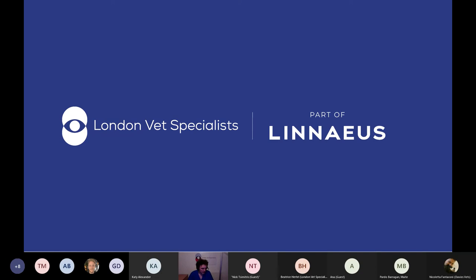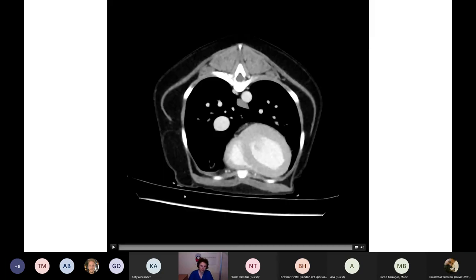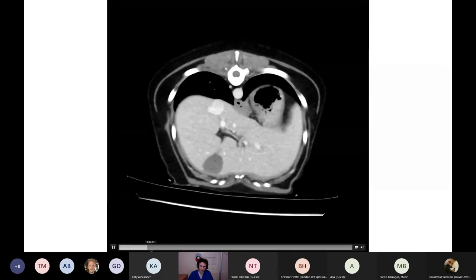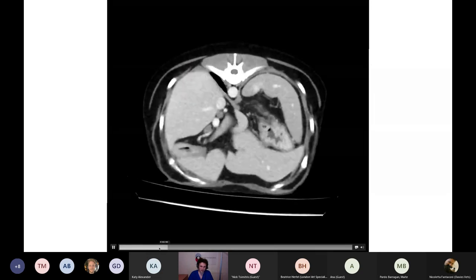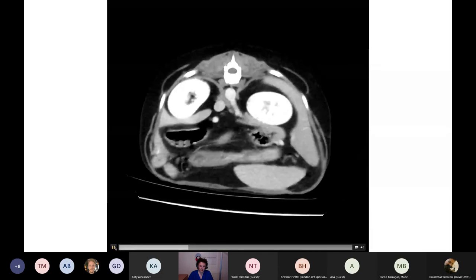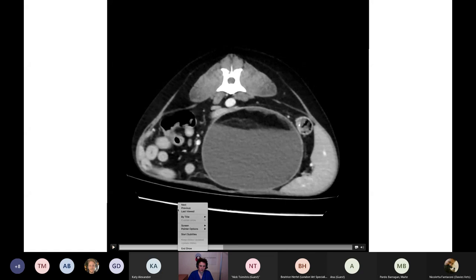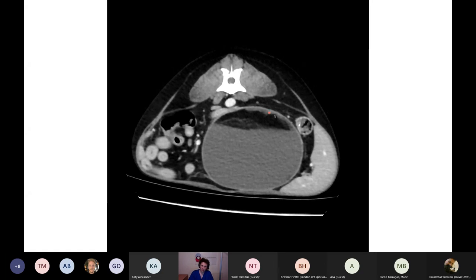So I see that Nicoletta has just asked, actually it was Luke that asked, any rim enhancement? Yeah, I think it probably was on the CT. It probably was a little bit of enhancement of the rim of this structure, which retrospectively is something that you might expect to see with an abscess. So yeah, that's again quite a pertinent imaging feature here to take away. So if we just have a look at that. And yeah, this very thin wall that is enhancing relatively strongly.